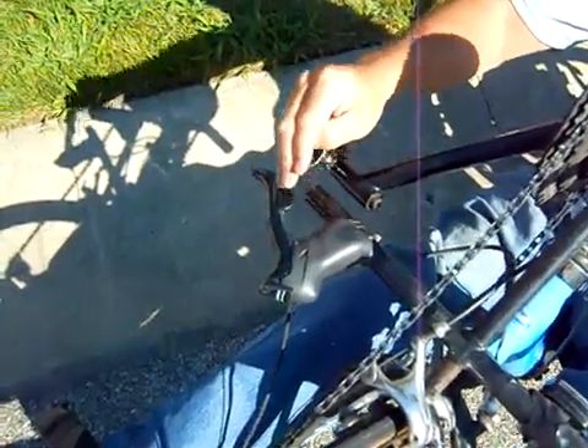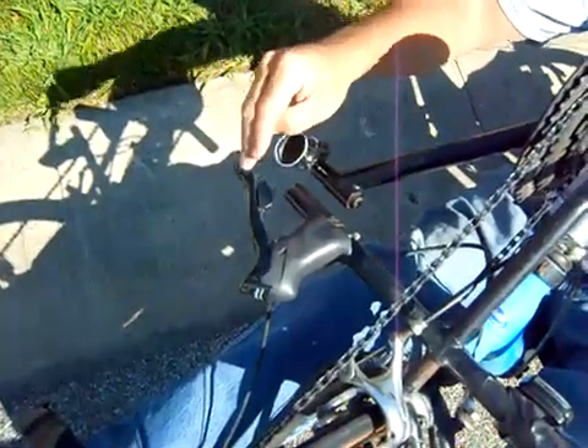There is a downshift — you push the small lever here. You upshift by pushing the larger lever.